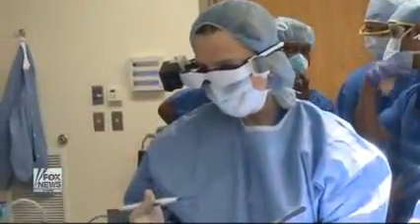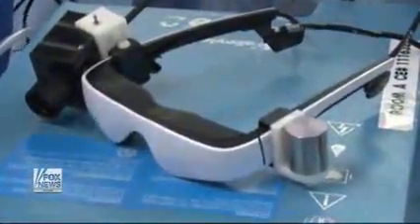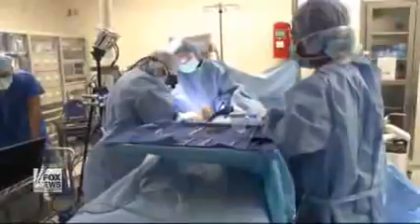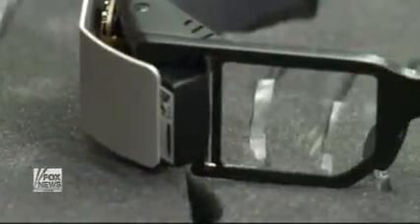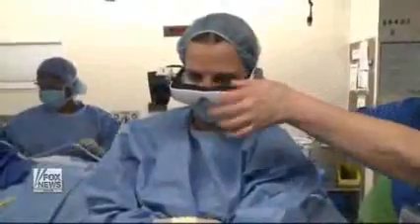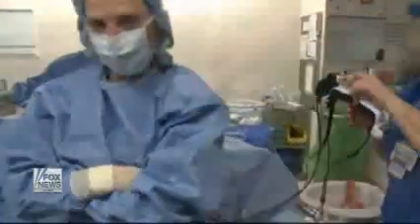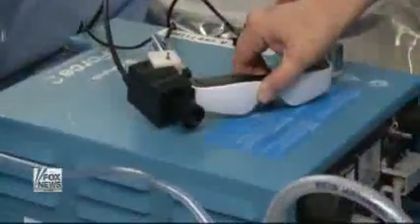Dr. Julie Margentaler was the first surgeon to use the space-age device on a breast cancer patient to determine whether it works. It does. I can see things very clearly. When Margentaler wore the goggles during Seguido's procedure, she wanted to know if they could identify margins around tumors and lymph nodes, which ultimately did confirm some microscopic tumor extension at those edges. So that was very exciting to us that we were able to see down to that level of detail. We would not have been able to see that without the goggles.